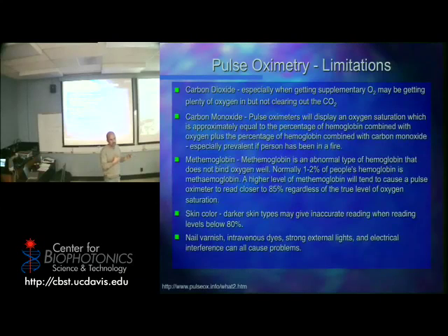So I'm not measuring CO2. If I wanted to measure CO2, I'd have to find something that the CO2 binds to that causes some kind of color change. Otherwise, do we see CO2? It doesn't have any optical properties in the visible range. There are other wavelengths we can use for CO2, but it gets much more complicated. So the easiest thing to measure is bound oxygen because it causes a relatively dramatic change in the hemoglobin. That's why we measure that. Ideally, we would measure a whole bunch of other things.